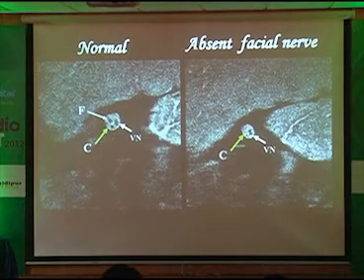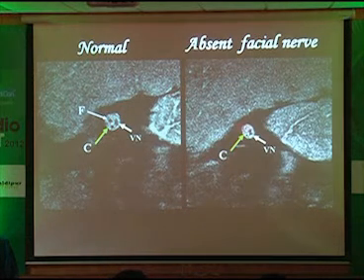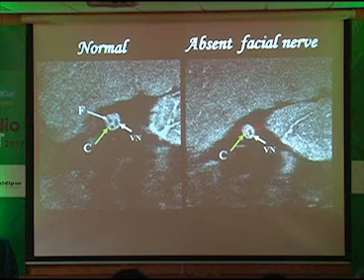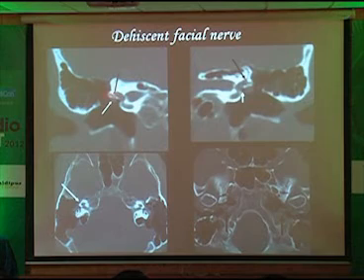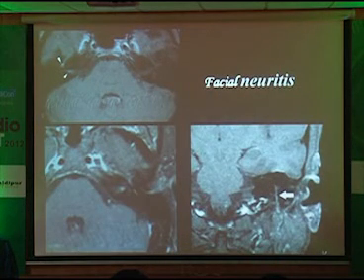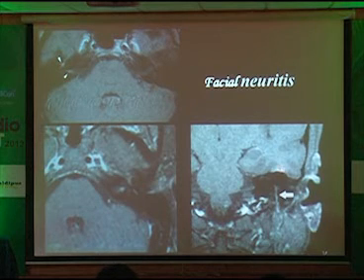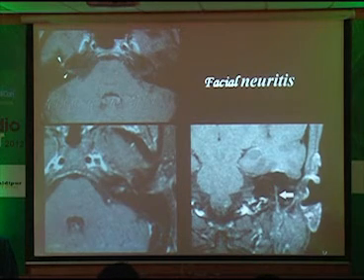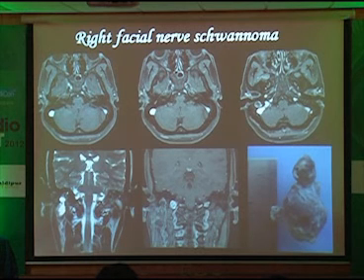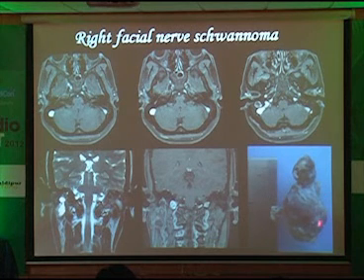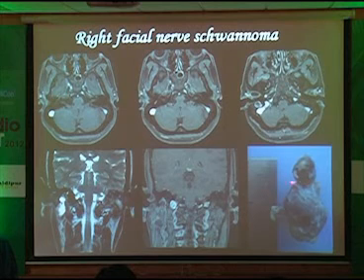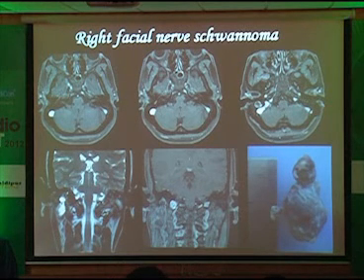Facial nerve — last three slides. Cochlear and facial nerves should be of the same size; this patient has absence of the facial nerve superiorly — no facial nerve, while the vestibulocochlear nerve is seen. Dehiscent facial nerve: there is no bony covering for the tympanic portion of the facial nerve, which is exposed. Facial neuritis can enhance on MR — you see enhancement of the mastoid and labyrinthine portions. A facial nerve neuroma showed an hourglass shape with the mastoid portion involved, extending into the parapharyngeal space through the stylomastoid foramen.